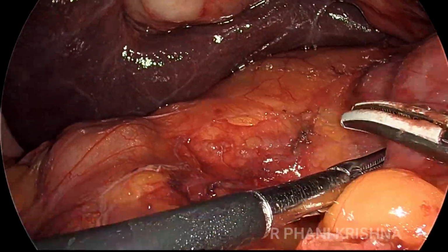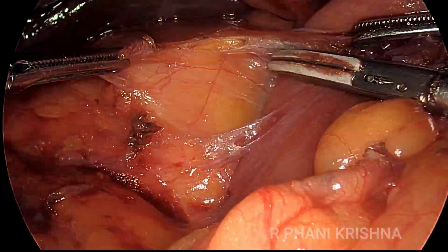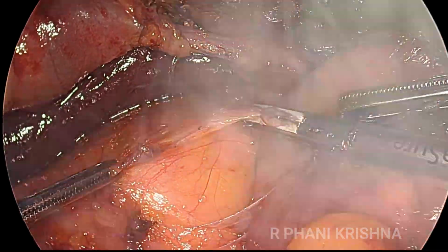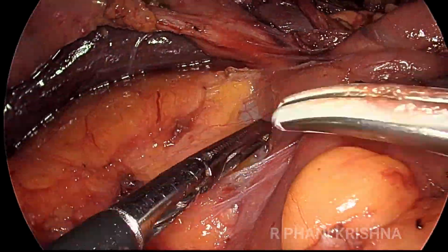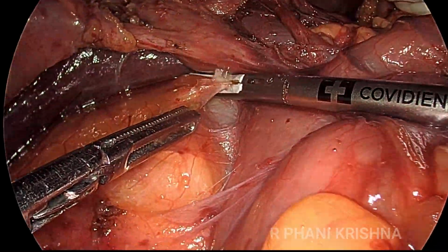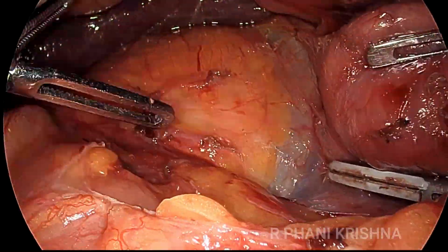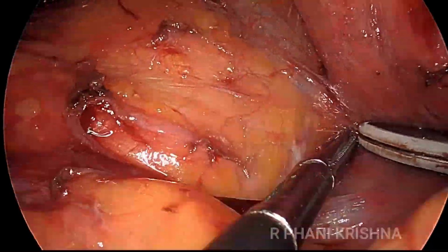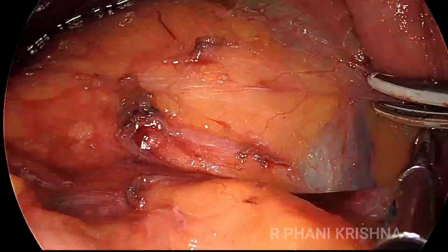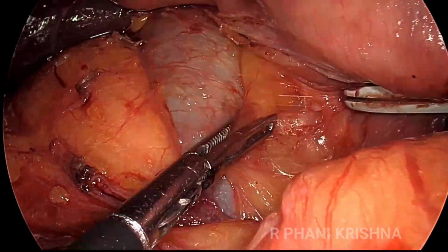For this Kocherization, the camera can be in the midline port, or if it's difficult, the surgeon can shift to the right side and work from the right side, while the assistant provides retraction of the duodenum from the left side. With this retraction, the duodenum is being lifted up and the retroperitoneal attachments of the duodenum are progressively lysed. You can see the landmarks coming into the view, the IVC and the gonadal vein.